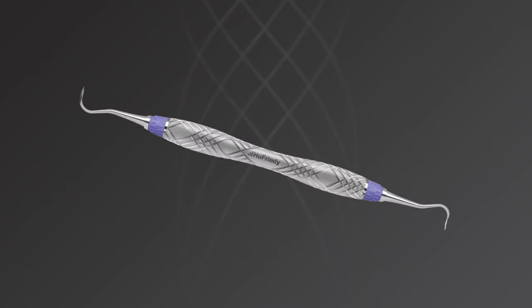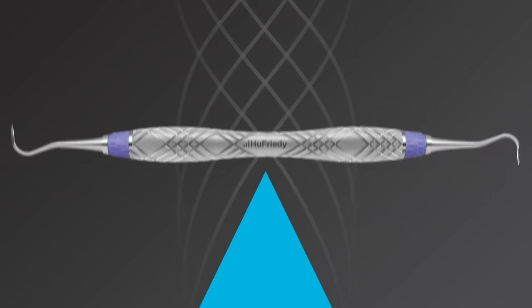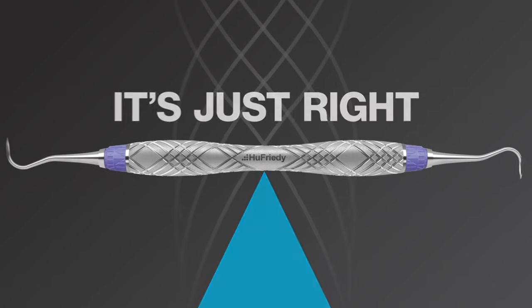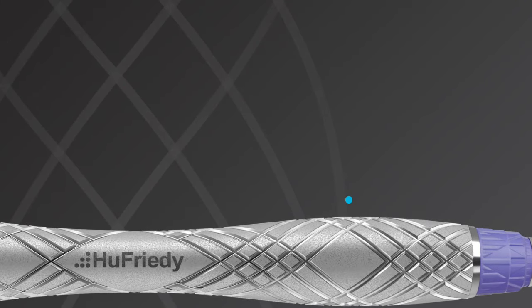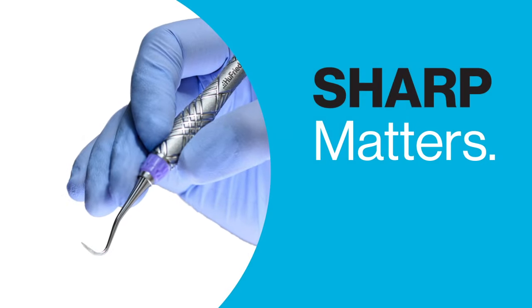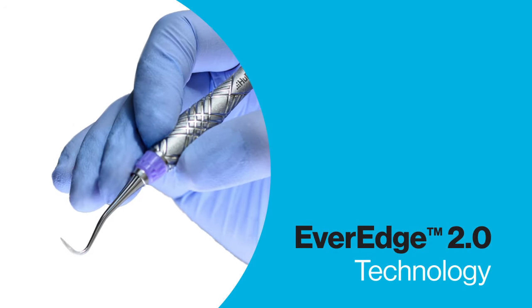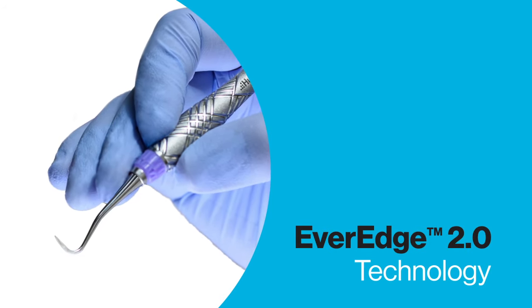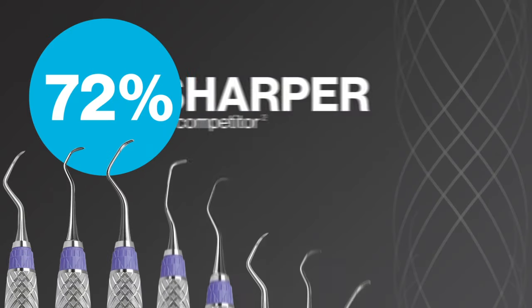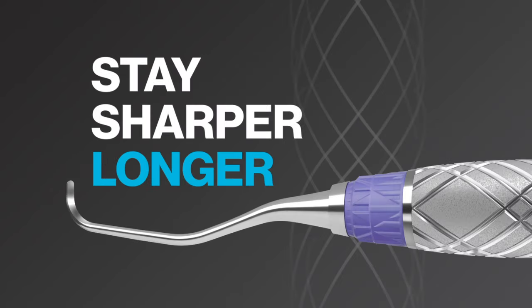With an unparalleled level of precision manufacturing, Harmony Scalers and Curettes are perfectly balanced. And unlike other alternative materials, the metal Harmony handle provides durability and allows for superior tactile sensitivity. Harmony Ergonomic Scalers also have the benefit of EverEdge 2.0 technology, which you know and love because EverEdge 2.0 scalers and curettes are 72% sharper than the next leading competitor and stay sharper longer.